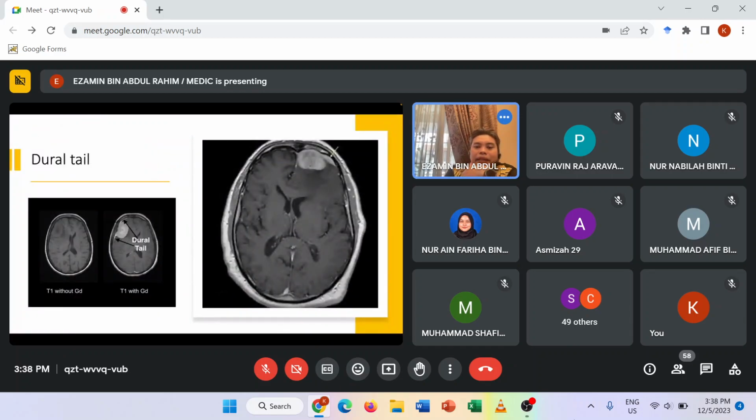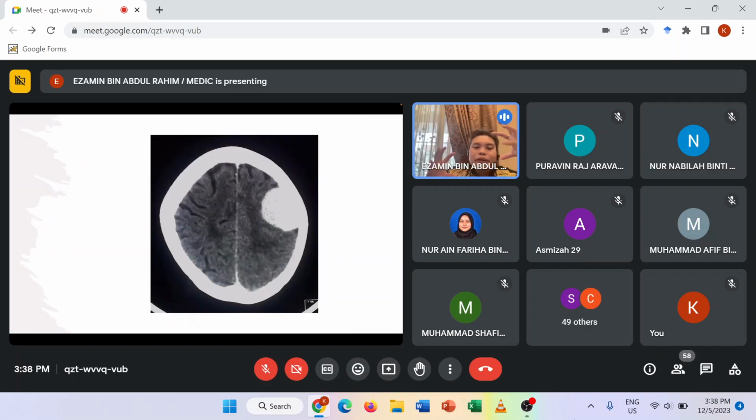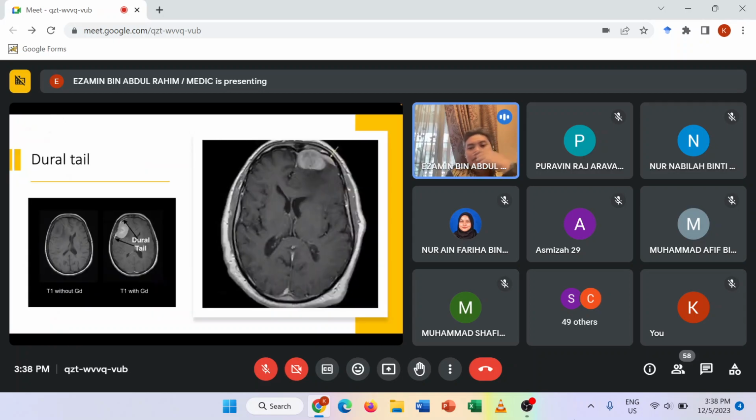And then one peculiar thing, quite pathognomonic juga for meningioma, is what we call dural tail ni lah. Because it's from the meninges kan. So dia adalah sikit macam thickening, so like this. And then this usually selalunya hyperintense or on CT dia bright because of the cellular component tu, dura punya cellular component tu, dia very packed. So that's why dia jadi macam tu.